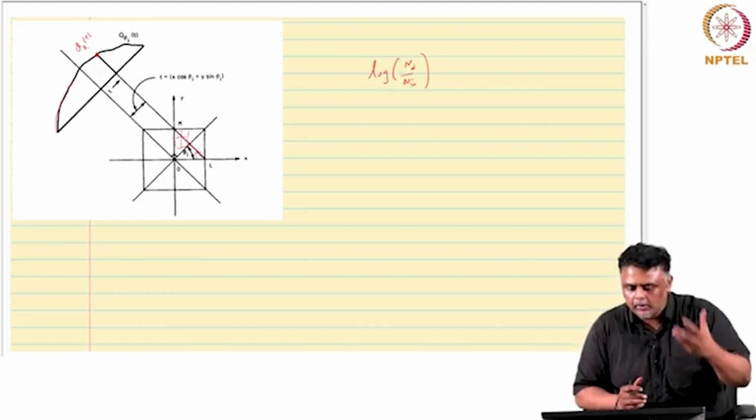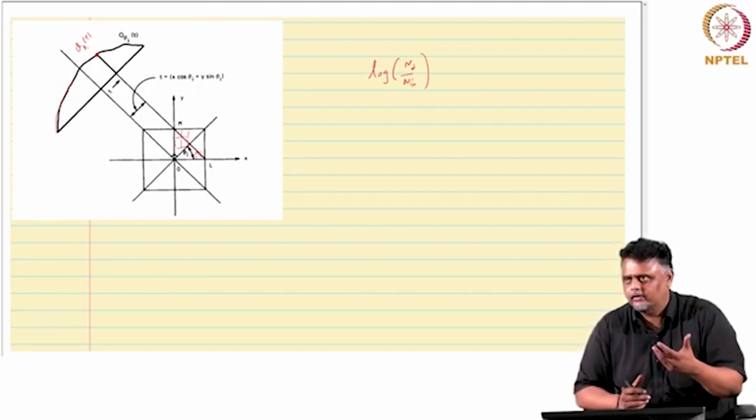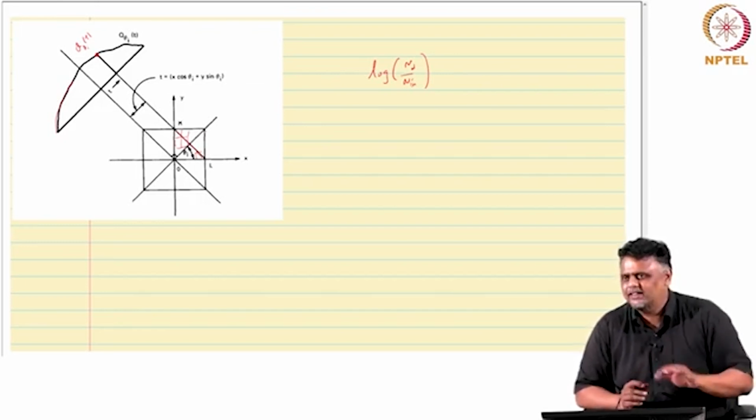It actually comes out of the derivation, but I will not go through that. You have to take the raw projection, which is this log data, and filter it. It is a digital filter, so you use a fast Fourier transform to filter, and then take that filtered projection and back project. So, this is a typical algorithm.